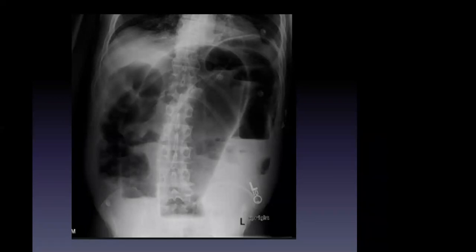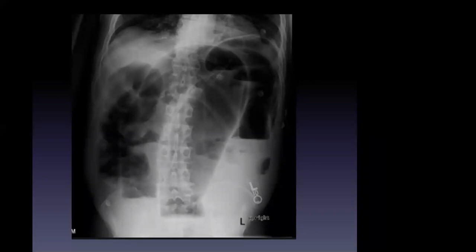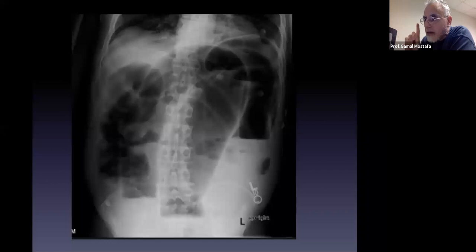Can show any perforation, retroperitoneal from the left colon. What did we say that could be? Could be obstruction or what? Pseudo-obstruction. So the first and the most important question that the CT with rectal contrast is going to give you the answer for immediately is: is that obstruction or not? You're going to inject rectal contrast in that. It's going to go straight to the cecum. No mechanical obstruction. Totally different disease.